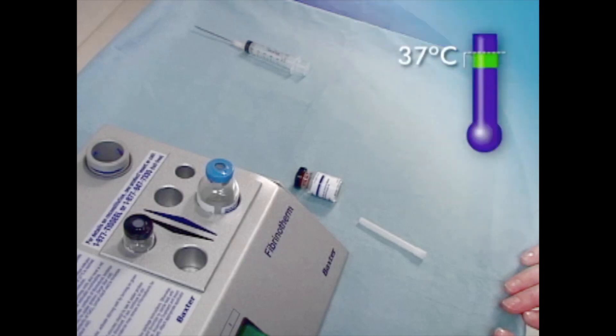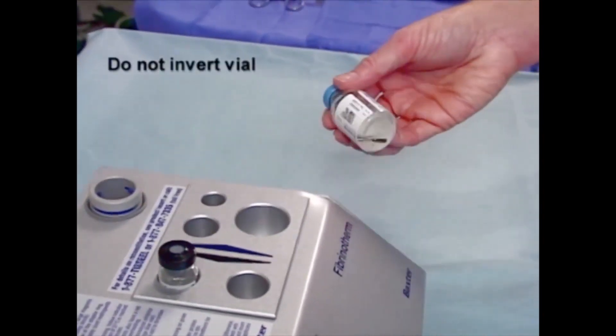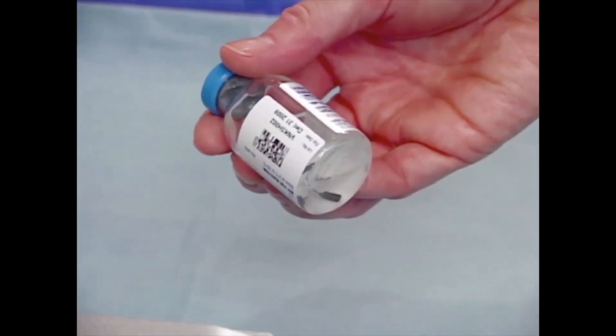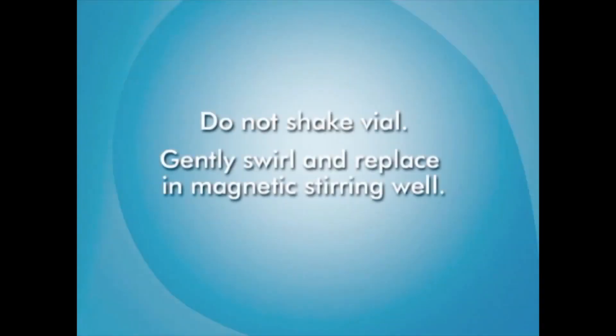Keep the thrombin solution at 37 degrees Celsius until needed. Check the sealer protein vial to make sure that the dry powder is completely dissolved in the fibrinolysis inhibitor and that no particles are sticking to the upper portion of the vial. If any of the freeze-dried sealer protein is visible, do not shake the vial, but gently swirl it and then replace it in the magnetic stirring well. When thoroughly mixed, the sealer protein solution should appear as a thick, slightly opaque, homogenous solution. If the sealer protein concentrate has not dissolved within 20 minutes using the Fibrinotherm device, discard the vial and prepare a fresh kit.